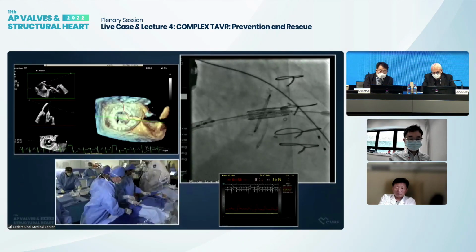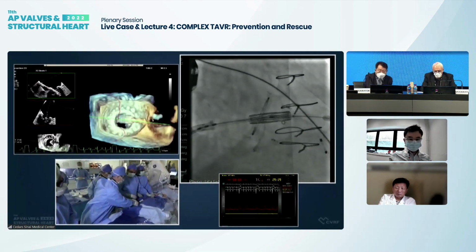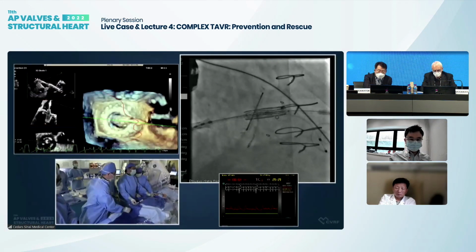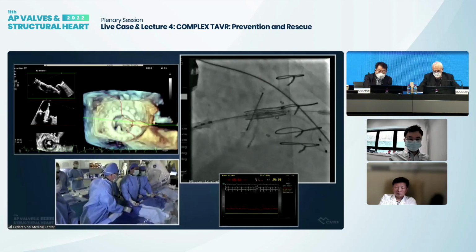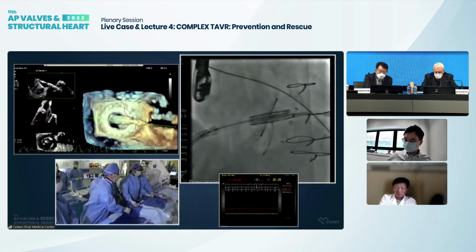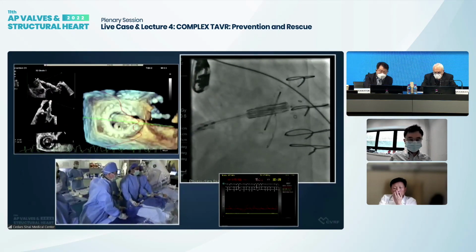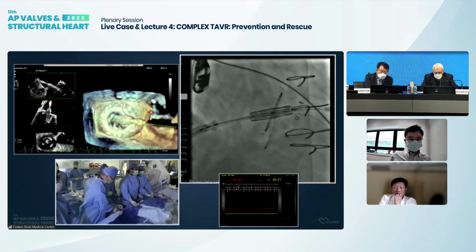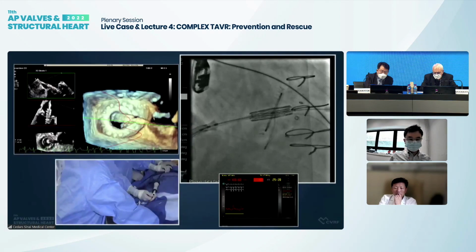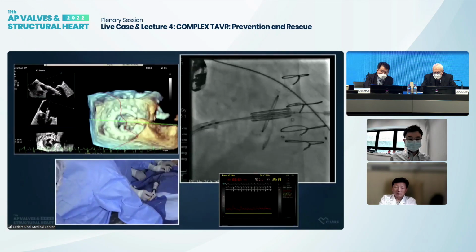Okay, Jubin, you come in the front here. I'm going to hold this. Are we all ready, guys? You fine-tune while you deploy, correct? That's correct. It's always easier to push in. It is harder to pull back. I like to be like this a little bit, and we'll go up slowly, and that'll give us time. Even though this doesn't look perpendicular right now, it's okay because it will become coaxial.